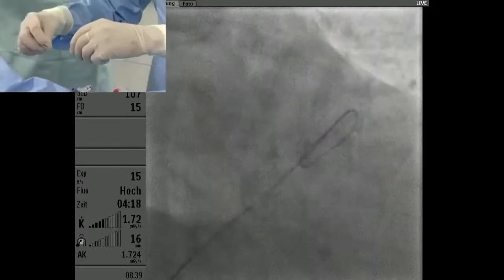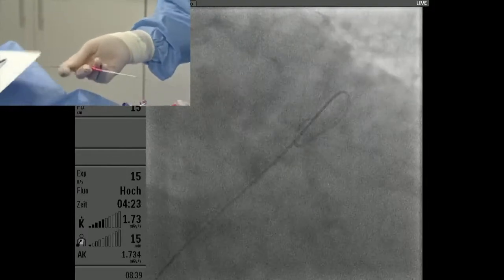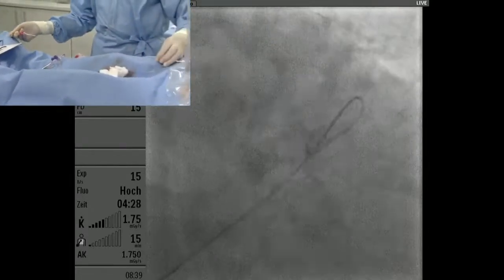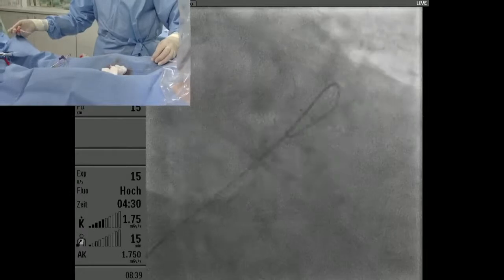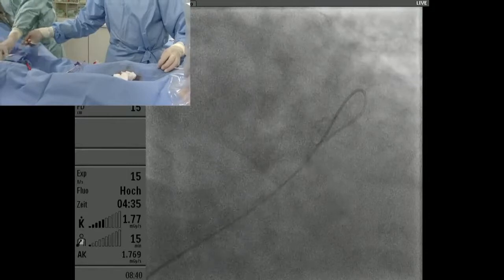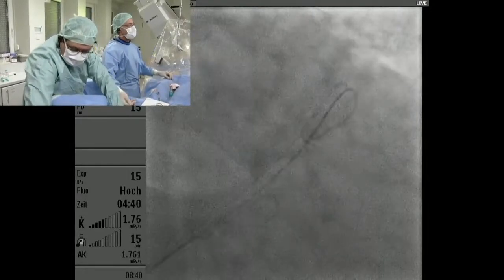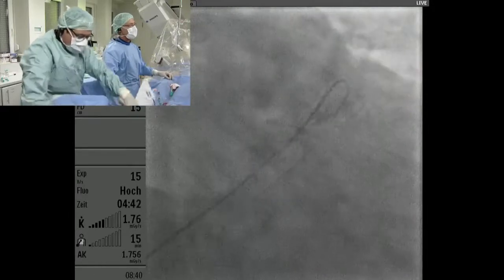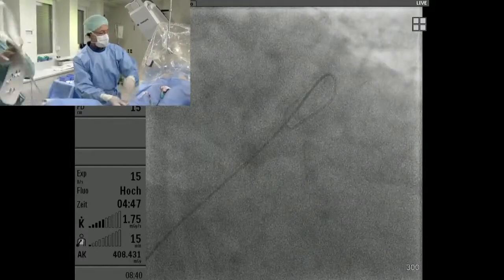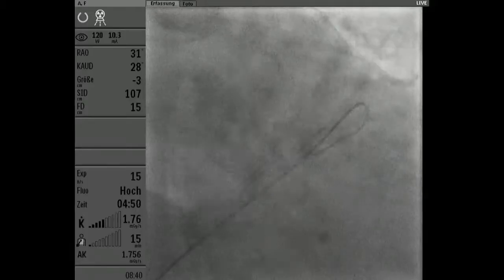There's always a debate about how to exchange the sheath. I'm using the Amplatz extra stiff wire and making a loop like with a pigtail, as you see here. If you do this over the wire, it's important to use Amplatz extra stiff with a 3 centimeter tip, because only that behaves like a pigtail. The other technique many other operators prefer is to go to the pulmonary vein and exchange in that position and then go down with the sheath into the appendage. I think both techniques are good alternatives.